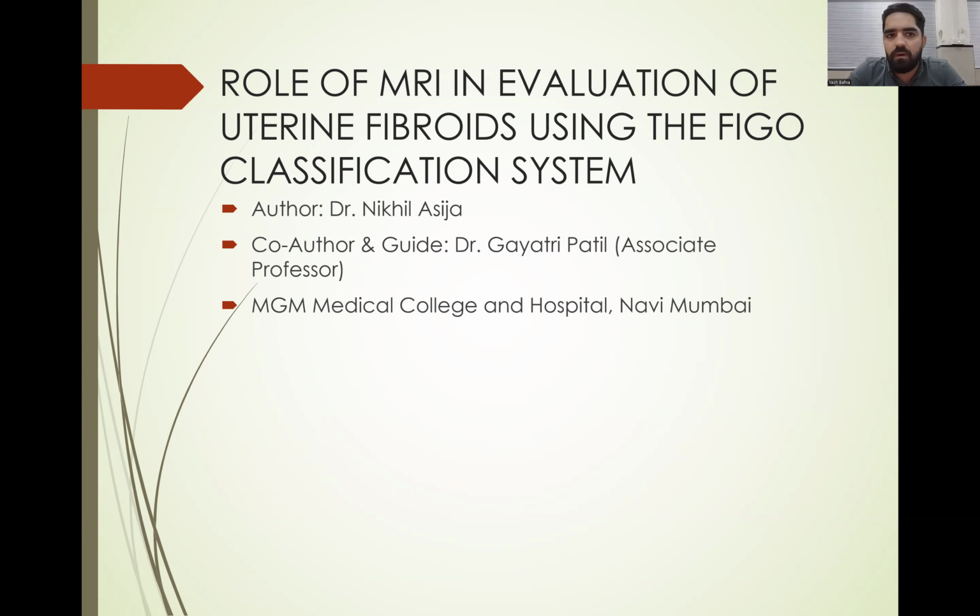Today, my paper presentation topic is role of MRI in evaluation of uterine fibroids using the FIGO classification system. My co-author and guide is Dr. Gayatri Patil.